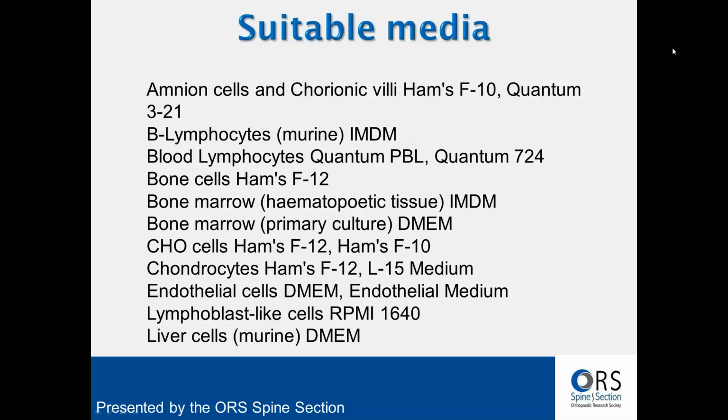Chondrocytes, which over the years have been thought to be the cousins of disc cells, look, their media is Ham's F12. But if you go in the literature, DMEM is the one that is used. Why? Because of history. When a big person in the field uses it, and it was first used by Dr. Dingle for chondrocytes at Cambridge University, everybody followed. So there's no rationale why DMEM is being used in the disc field.